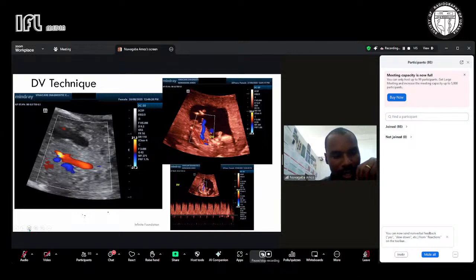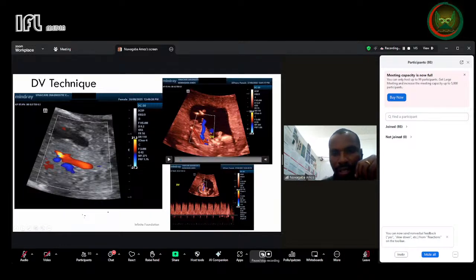In this slide, I have short videos that show us the technique.